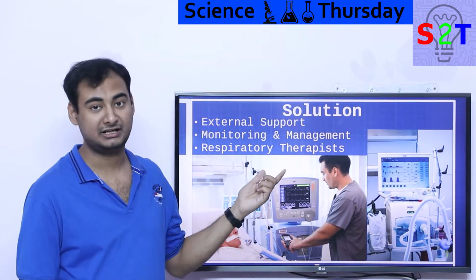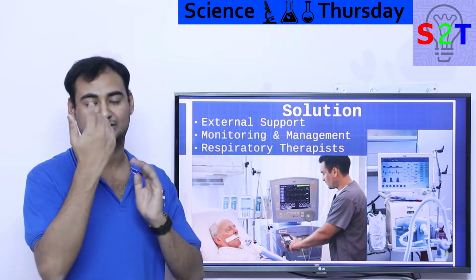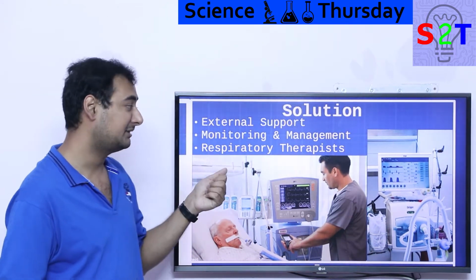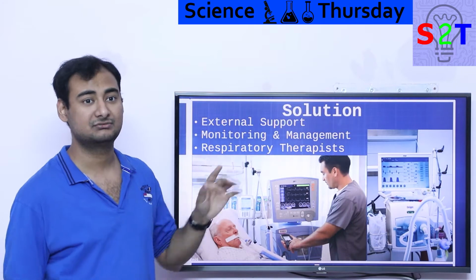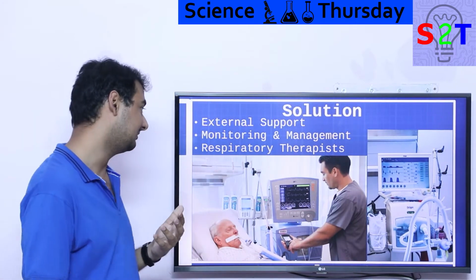Now this requires monitoring and measuring, because it's not a continuous system. It's not like, okay, pump oxygen in and then carbon dioxide will go out from another vent. It's not like that. It's like a rhythm. So it requires continuous monitoring and measurement. That's why you see giant LCDs in every ventilator system. It's kind of necessary, because if you don't see how it's working over time, for at least 15 or 20 seconds, you will not get a clear picture of that.